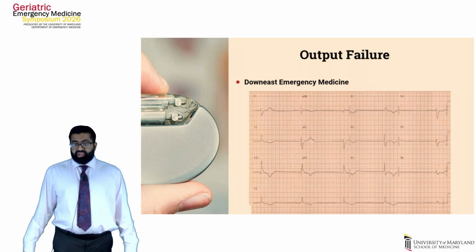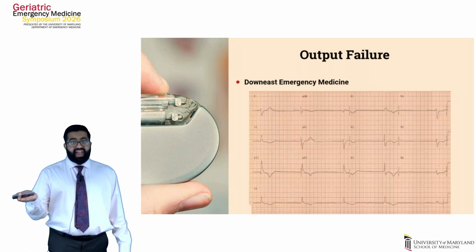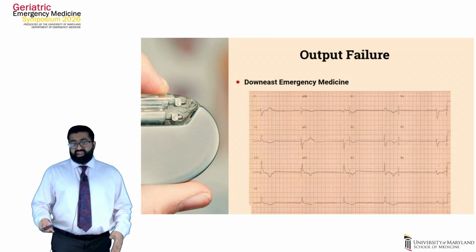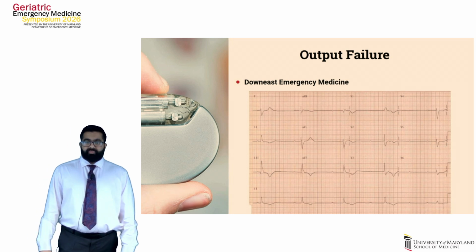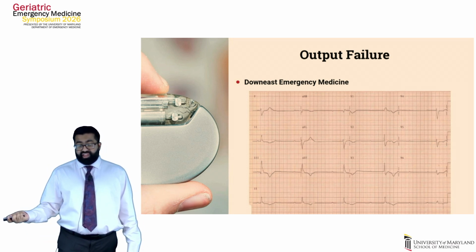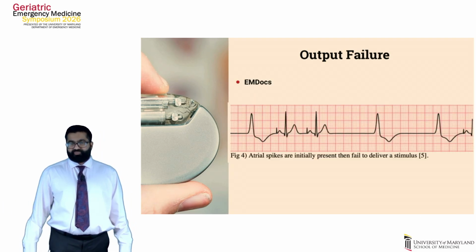Well, you may not even believe me if I tell you that this patient had a pacemaker. This patient is in a bradycardic rhythm. Not just that, they're in heart block. This is an example of a pacemaker that has completely had output failure from a battery gone awry.